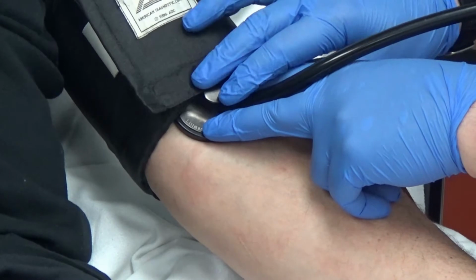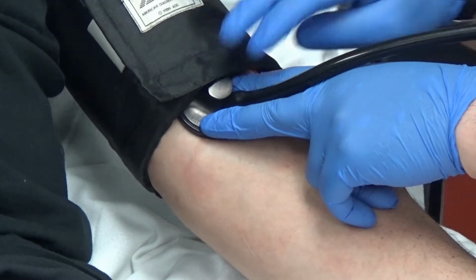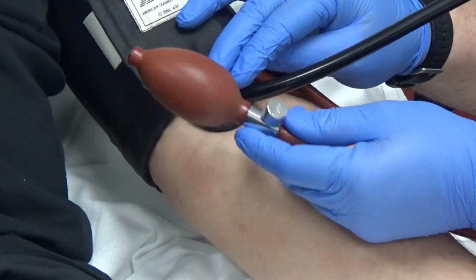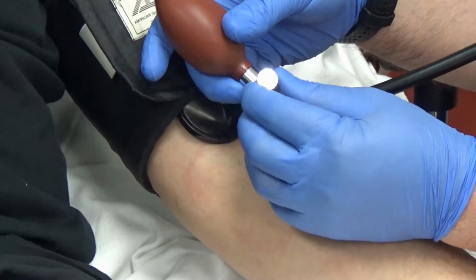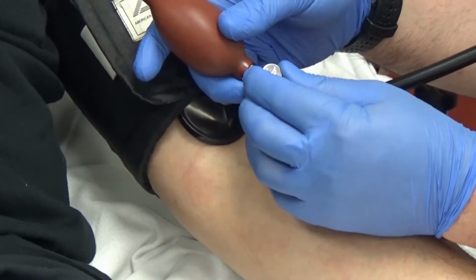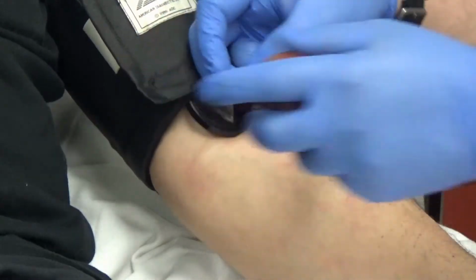Show that bulb in the video. Okay, there you go. There's our bulb, okay? And it has a little dial on it, clockwise and counterclockwise. If you go clockwise, it tightens it, it actually closes it. Counterclockwise actually opens it, okay?